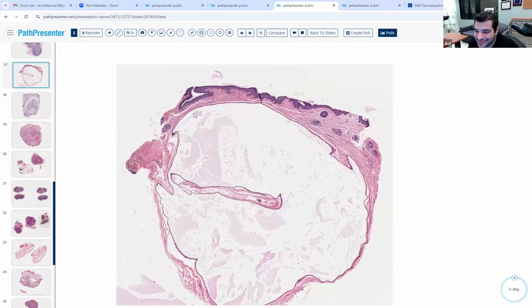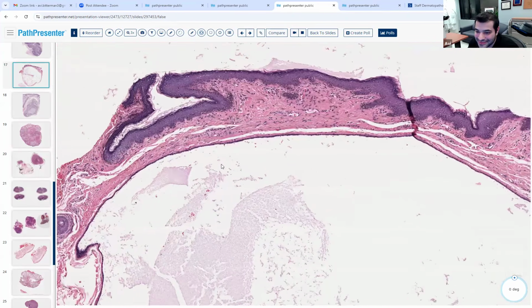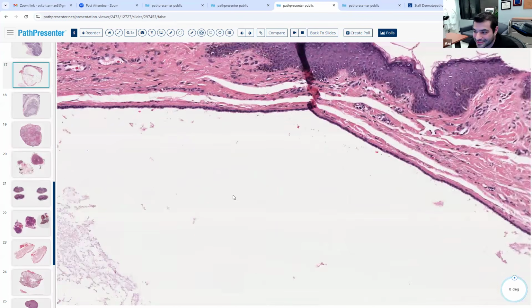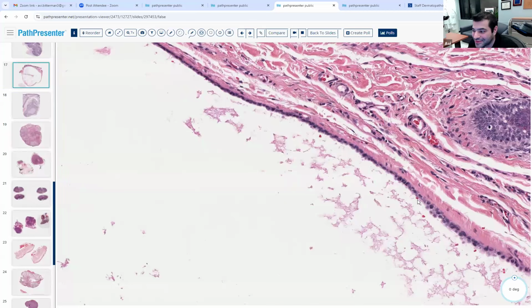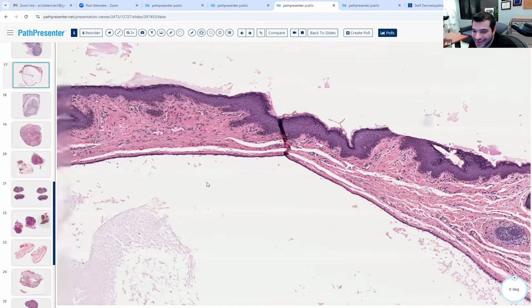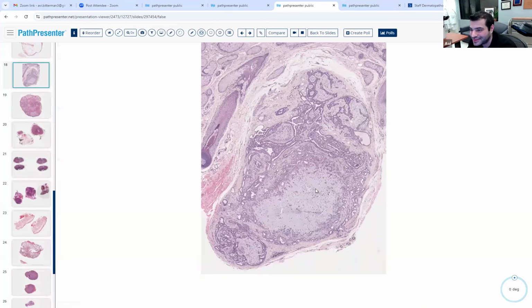So you see a lining with sweat or some sort of secretion, and a really simple lining with some areas of decapitation secretion. Is it a hidrocystoma? Yeah, the simplest apocrine cystic neoplasm that we typically see. This is just a large example of it. As opposed to this, which is more complex.